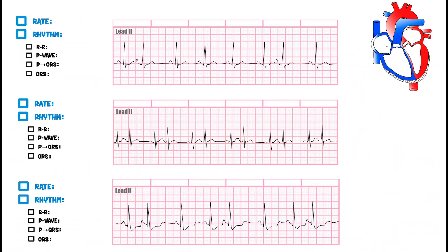In this video we're going to talk about how to determine the rate and rhythm for the following rhythm strips. These are going to be premature atrial contractions, which we also call PACs.